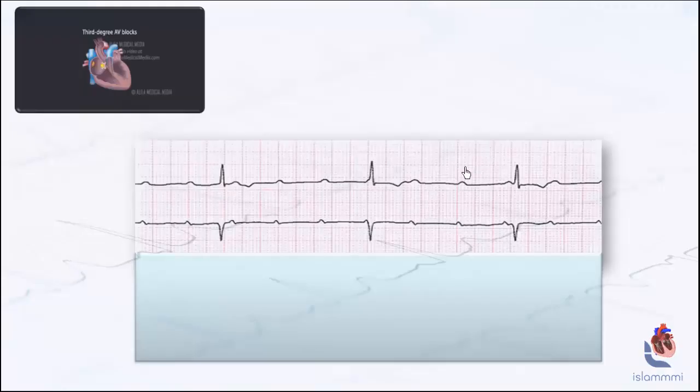So how can we find this? We know that if we have bradycardia like this, and the PR interval here is very variable, you cannot apply the first rule or second rule, I mean type 1 or type 2. There is no gradual prolongation and drop like that. Once you find the distance is very wide like that, we have extreme bradycardia.